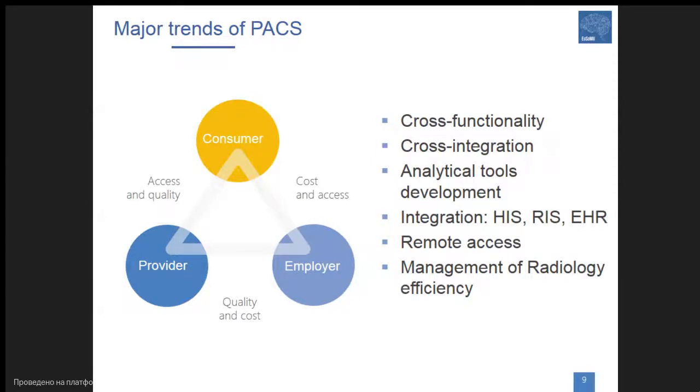The major trends of today's PACS are providing cross-functionality, again cross-integration, but also analytical tools, which allow not only seeing the images and demonstrating them to radiologists or clinicians, but also analyzing the efficiency of the radiology department and managing it. So PACS has become a solution and a tool not only for clinical work, but also for management work.